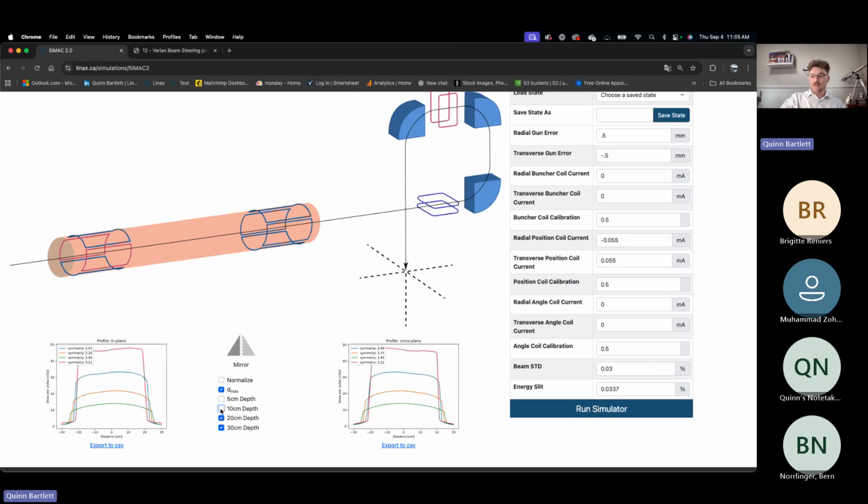But another useful one on this to just see small changes in symmetry is our mirror function. When you select the mirror function, it'll just flip your profiles for you. With our large asymmetry, it's very easy to see naturally on a plot. But when you have smaller asymmetries, doing this little mirror function allows you to flip it and see if there's any changes from side to side.